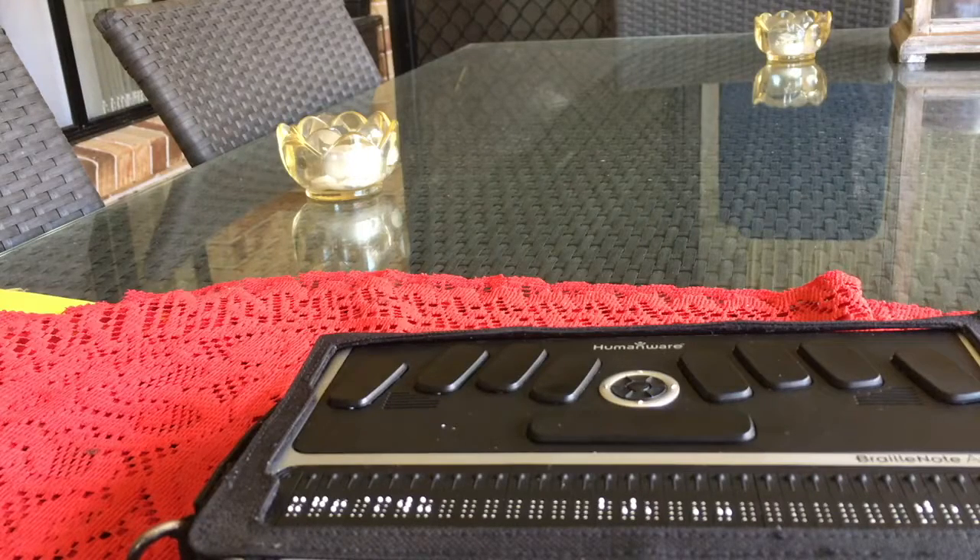Hello again, Internet. This is Cat Tiger from Blind Cat Blues, and I'm continuing my coverage of BrailleNote Apex. I'm going to show you guys how to pair your BrailleNote with an iOS device. This pairing is a little bit different to pairing most Bluetooth devices.